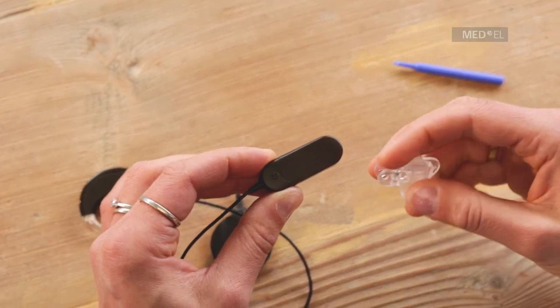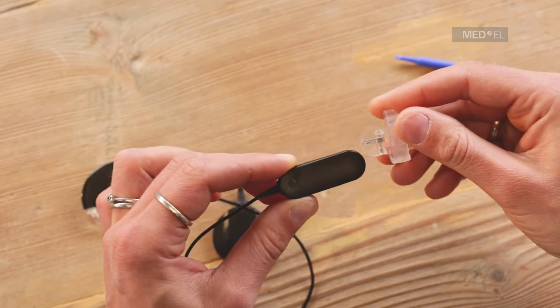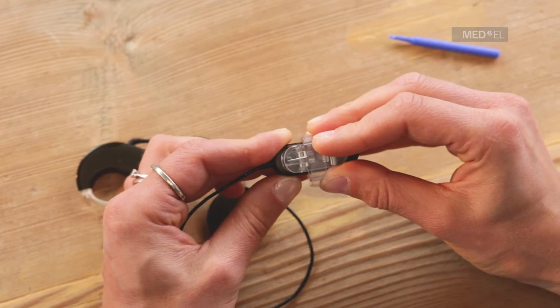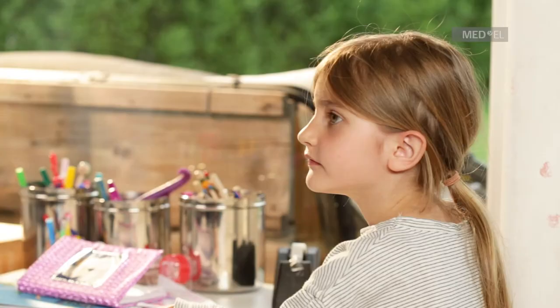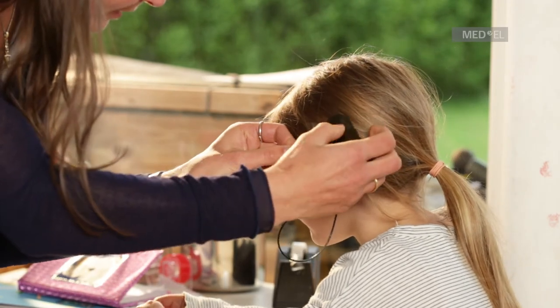On the cable connector there is a raised circular tab with the metal logo. Slide the small hole on the bottom of the attachment clip over this tab to keep it firmly in place. Now the battery pack can be clipped to clothing.